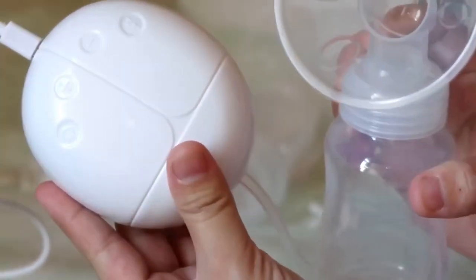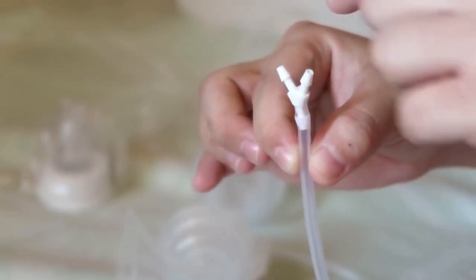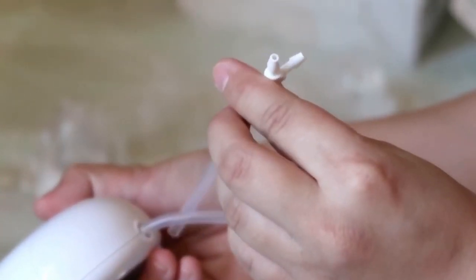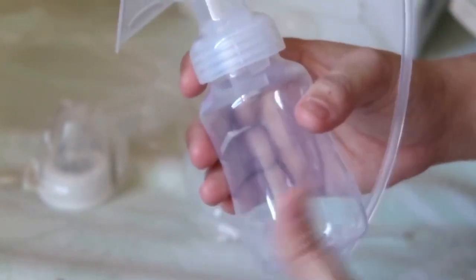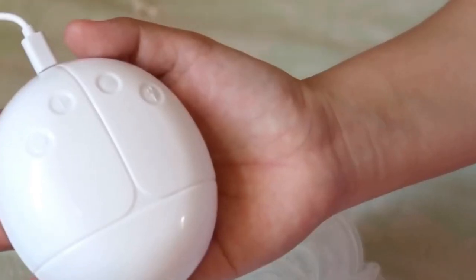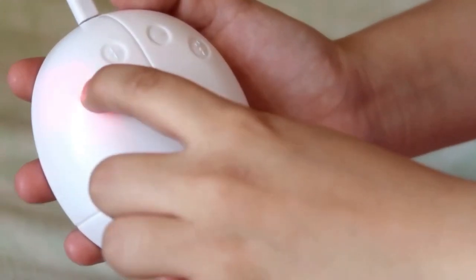So, ito yung pag single pump kayo, guys. And the other one, pag gusto nyo yung double pump, ito yung gagamitin nyo. I-connect nyo lang yung tubings dito, and ito yung ilalagay nyo sa ating motor pump. Ganun. So, tignan natin kung paano siya aandarin. And yun mga buttons dito ng motor pump. So, i-on na natin.